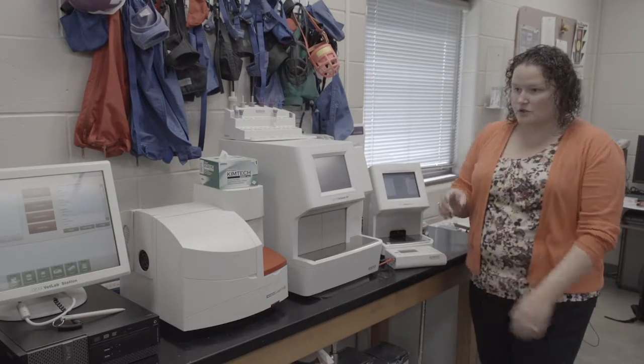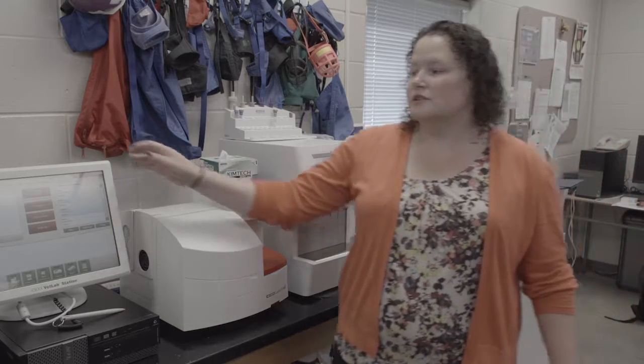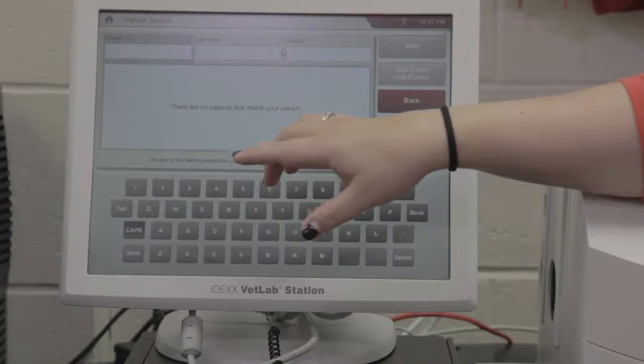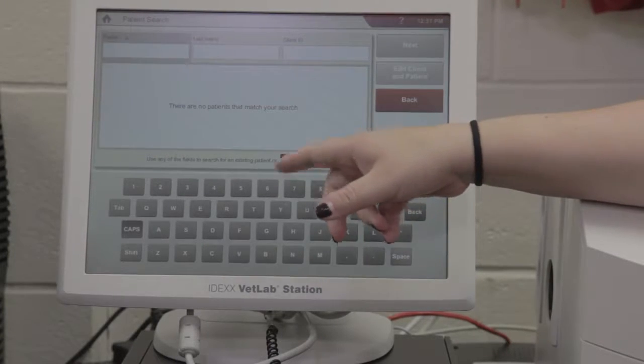Okay, so back here. To start your runs, you guys are going to start from the touchscreen. It likes a light tappy touch, so use your fingernail, or the non-writing end of a pen. And you're going to start from add new patient.